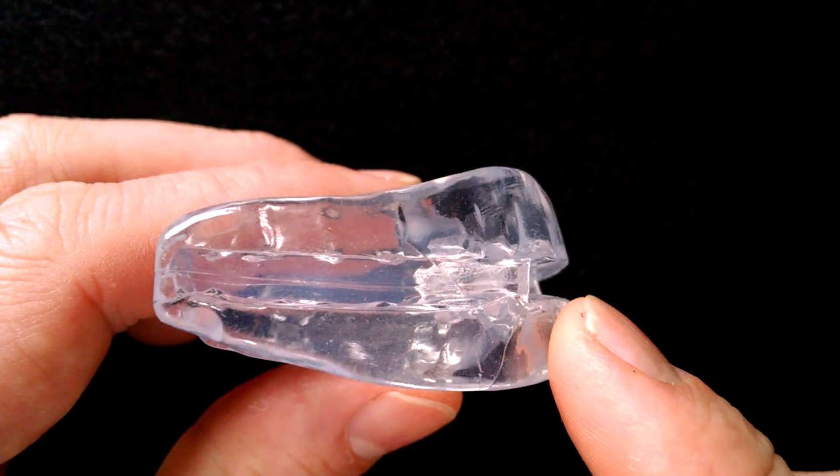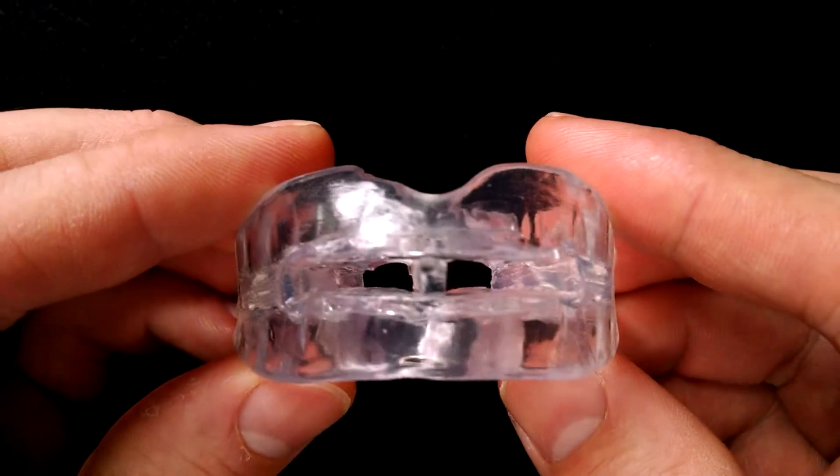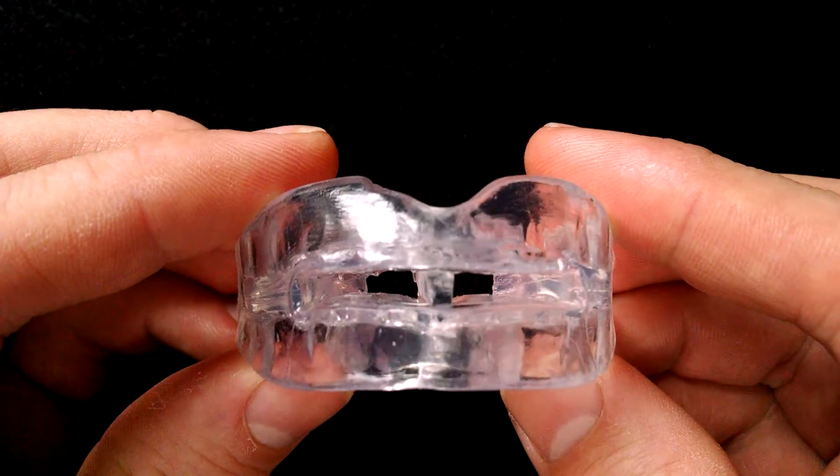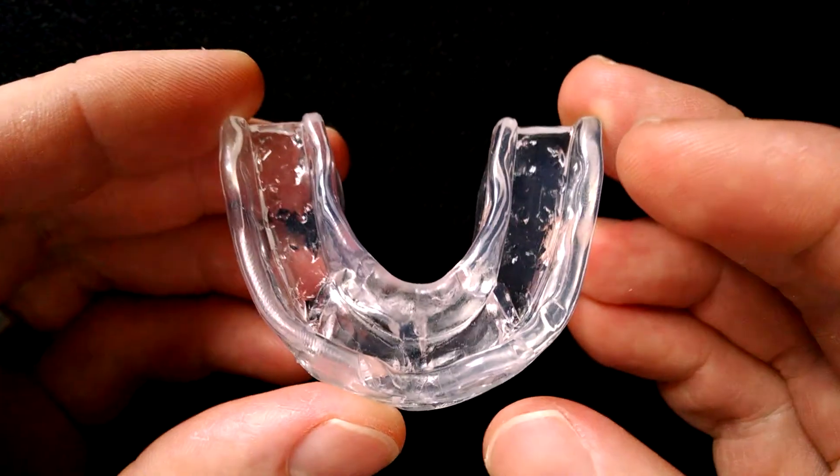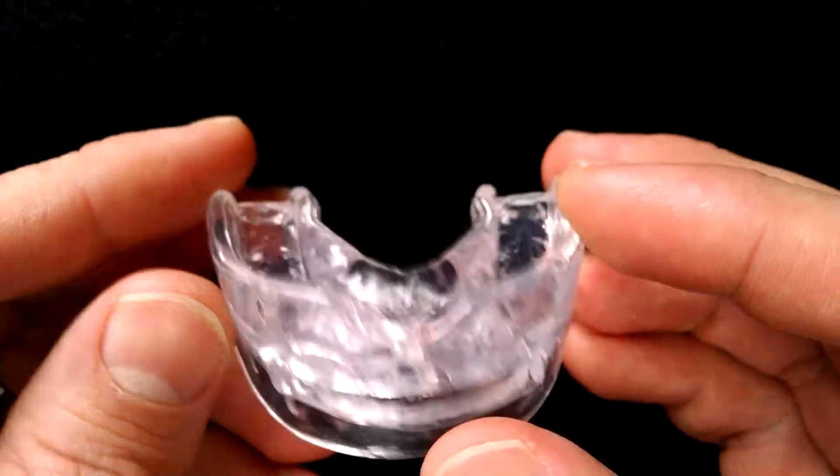So this is a simple boil and bite mandibular advancement device with a fairly large breather hole here at the front. This can be purchased from Rip Snore for about $70 and that includes shipping.